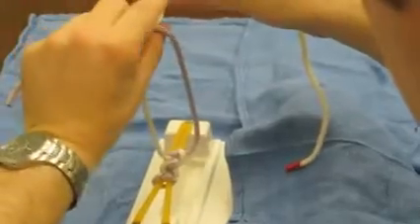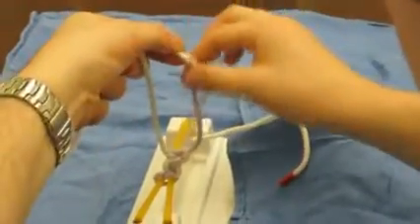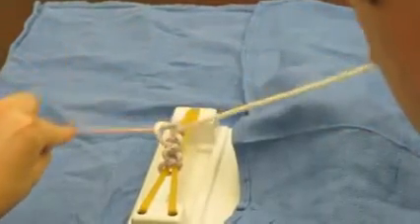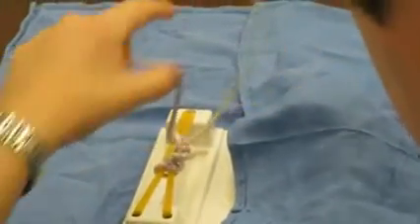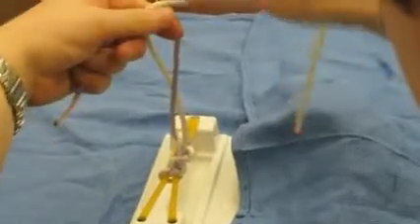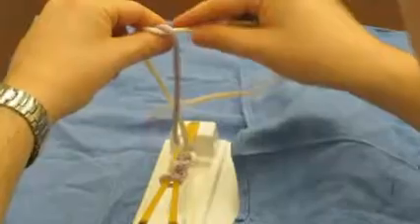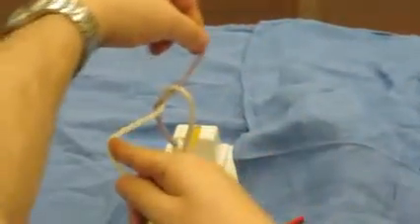the loop is on the finger. The thumb goes in to grab the tail, and the tail gets pulled out to one side. And on the second throw, the loop gets made on the thumb. The finger comes forward to grab the tail. The tail gets brought to the back. And then when you pull down, the tail has to go to the opposite side.